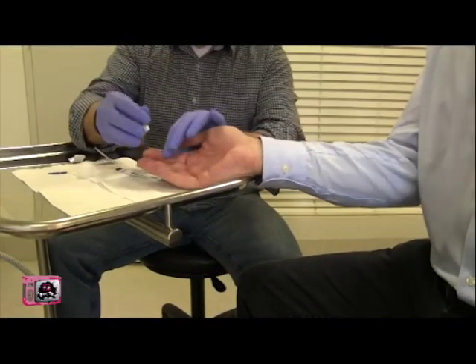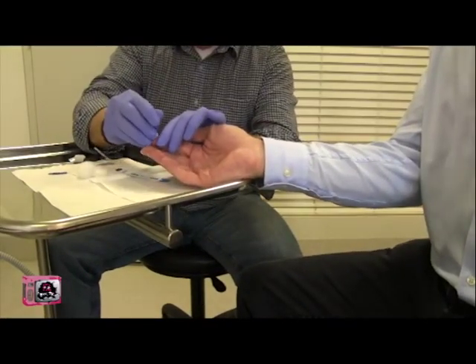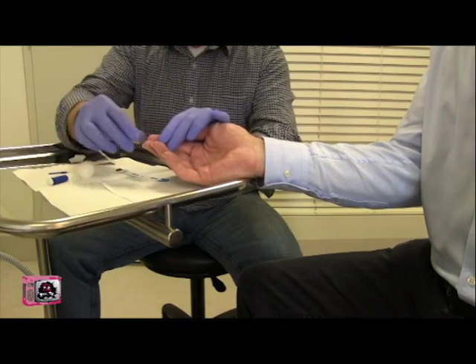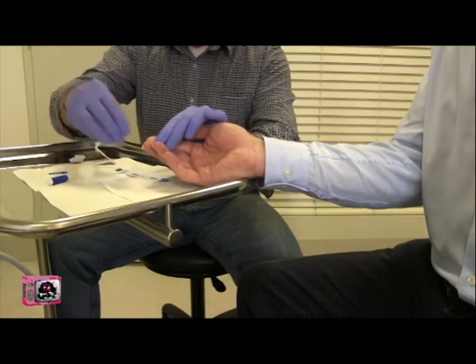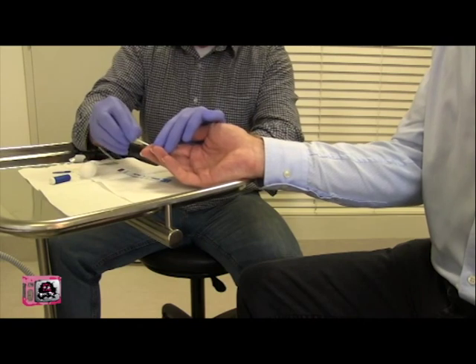So the first part is I'm just going to do a small finger prick here, a little sharp stick and we're just going to get a little drip of blood and I'll take a sample of that blood now.